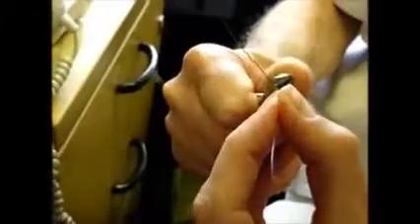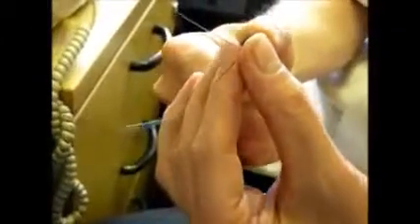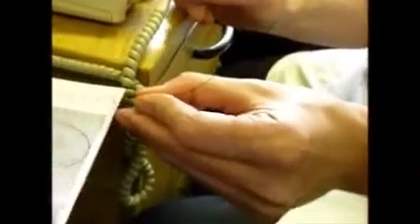Now you need to push the wire around the plier rather than turning the plier, because if you yank the plier you'll split the wire. That's one of the problems. And so you get a loop that's roughly 8.5, 9 millimeters tall, which is the right sort of size. So if you've got your own pair of pliers, then just get to know where on the plier will give you a loop of about the right height. And then what you've got to do is put the next right angle bend in.